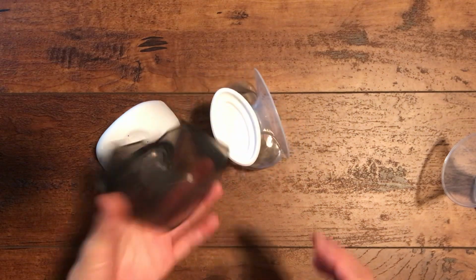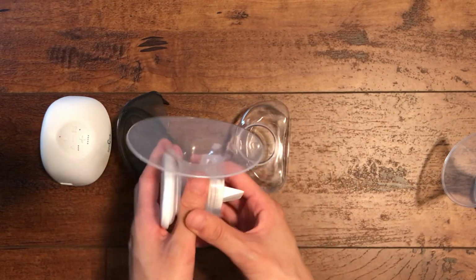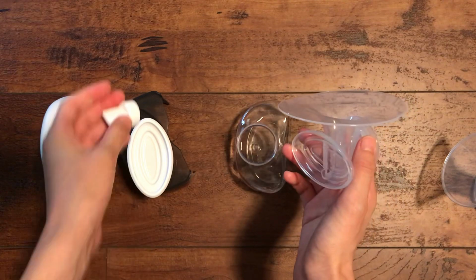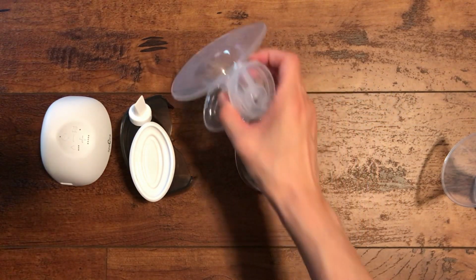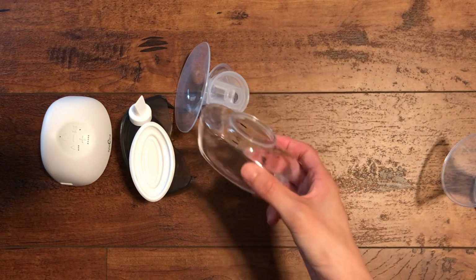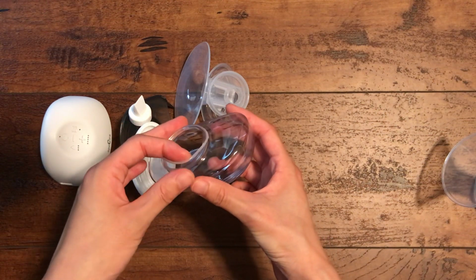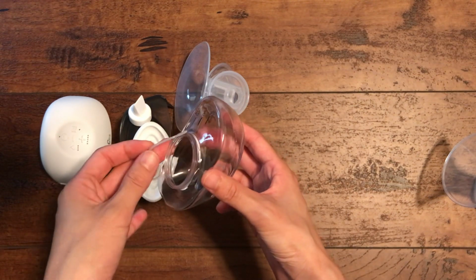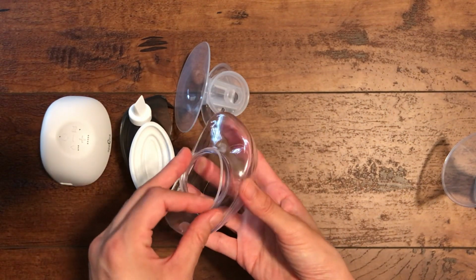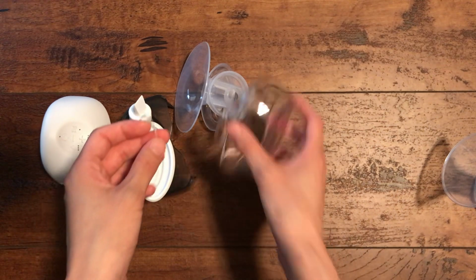So for the cleaning, you just disassemble everything. It's pretty much the same amount of parts that you have to clean, similar to the S1, so not too many are added. So I just take everything apart. One tip here is that I used to wash everything as is and dry everything as is and put them together, but I highly recommend disassembling this little ring part, the silicone ring that's creating the suction. I highly recommend removing this and letting both the bottle and the ring dry completely before you put them together, because otherwise you're going to feel that this is a little bit loose when you connect them all together later.